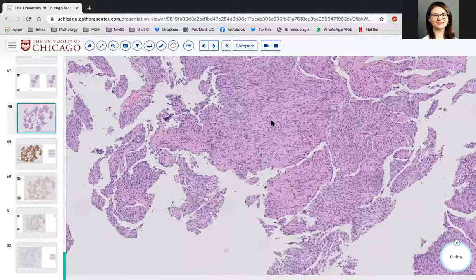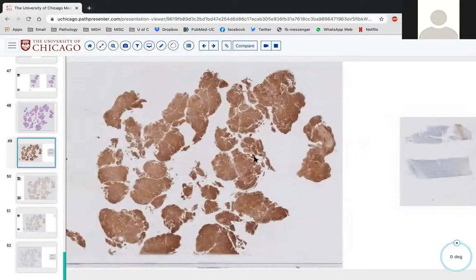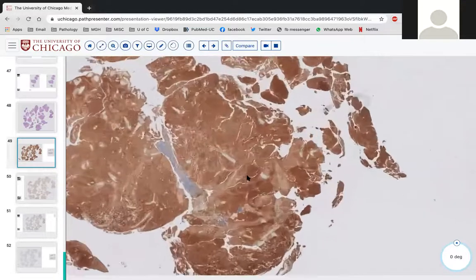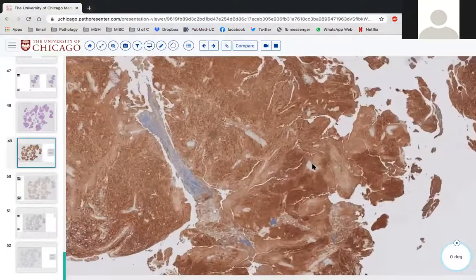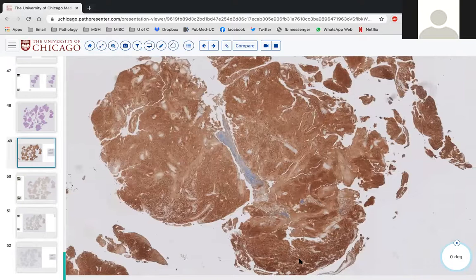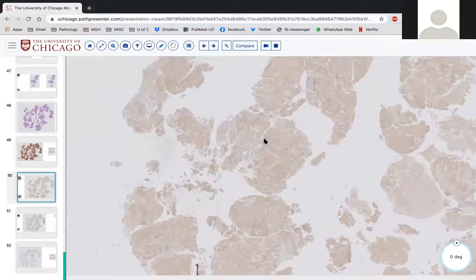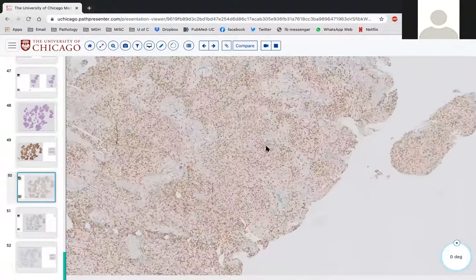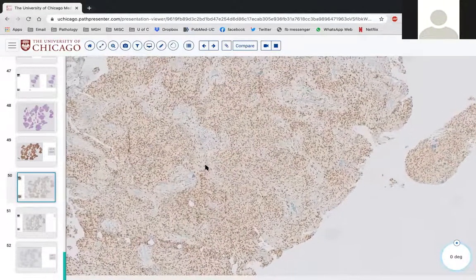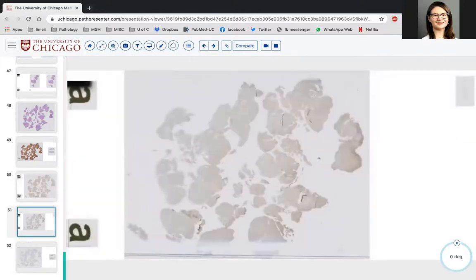So yeah, Reham has it in the chat. Sorry, Katie, you want to take over and show the stains? Sure. So yes, we were suspicious of a schwannoma. One stain that we added to the resection specimen was S100, which I think everyone can see is very positive. And then we have our SOX10, again positive, but with that odd staining like the core, where some of the spindled areas were negative, but overall definitely positive. Those could be just endothelial cells of background blood vessels.